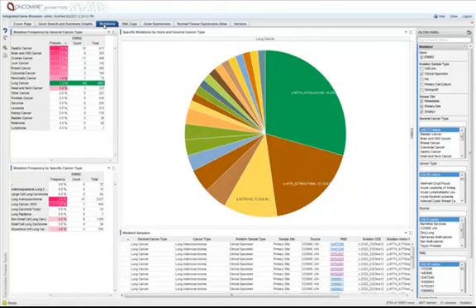So what I've got here now is a summary of all of the mutation data that we have for HER2. The table on the top left here shows you the number of cases that we have tested for HER2. And again, this is a compilation of data from COSMIC, from the TCGA, and other next-gen sequencing studies. And we're sorting by frequency of mutation. What you can see here is for most cancers, we only have a small number of cases with mutations observed, although multiple recurrent mutations. What I'm focusing on here is lung cancer.